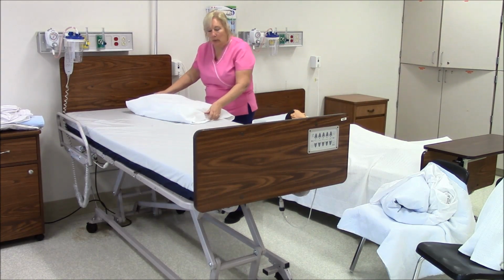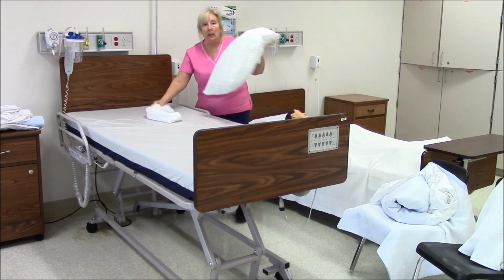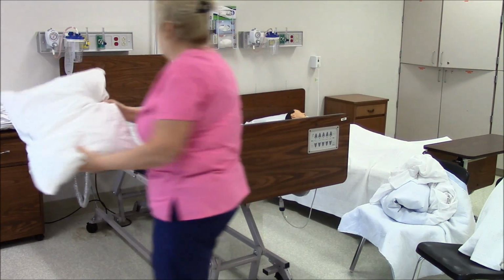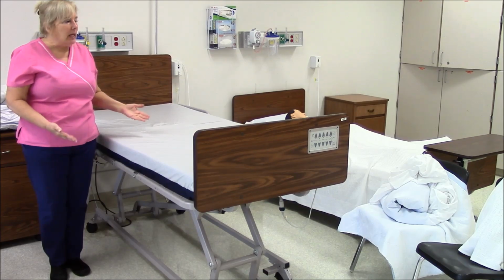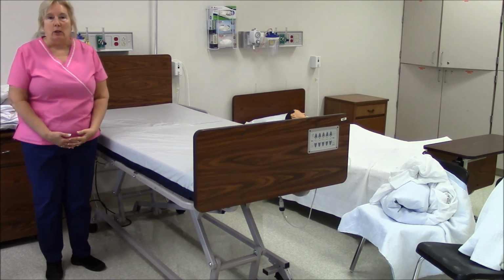Lastly, I will remove the pillowcase from the pillow. The pillow will be reused, and I will put that on a clean surface, which is the patient's nightstand. I am now ready to proceed with the procedure and make a closed bed.